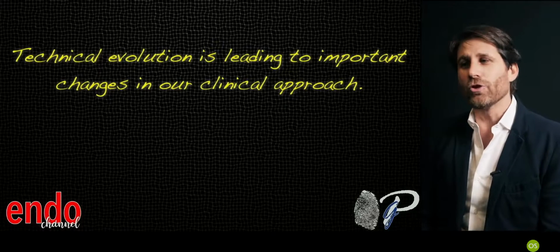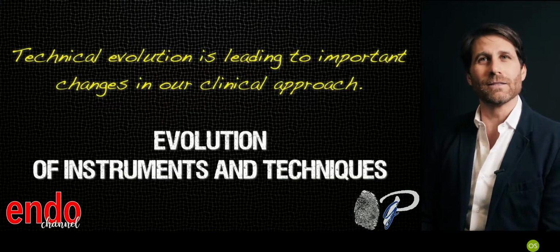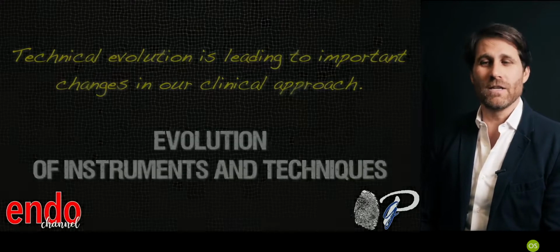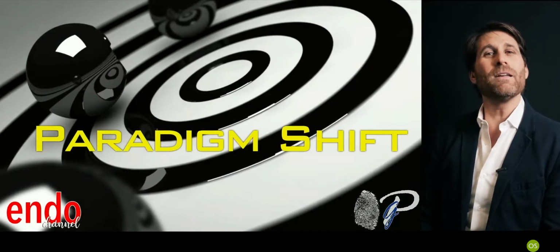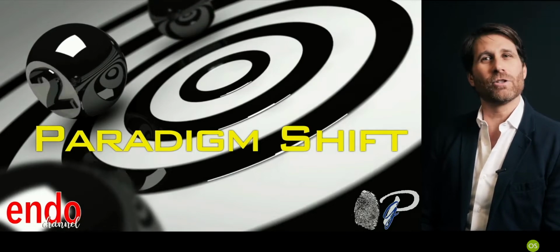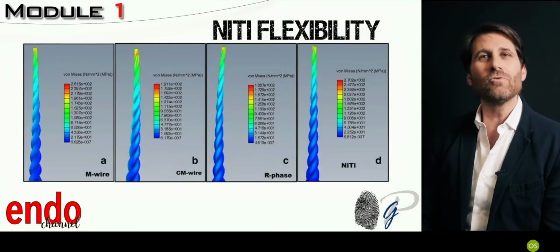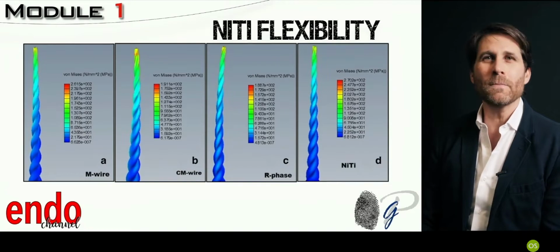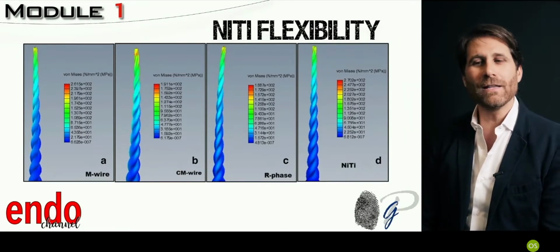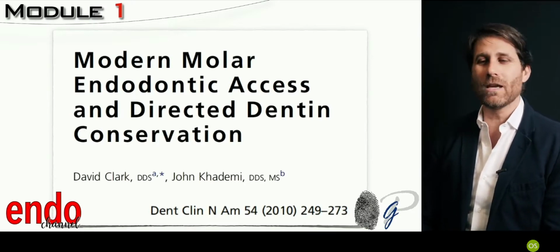Technical evolution is leading to important changes in our clinical approach. The evolution of instruments and techniques has given us a paradigm shift in our therapies. So we don't need to have myths and dogmas because everything is changing, the paradigms are shifting. And this is something that is happening very fast in the access cavity concept. Thanks to the flexibility of the new nickel titanium files, thanks to the properties and the resistance of these files, we can go over a modern molar endodontic access with the principles that David Clark and John Khademi gave us in this article. So very new principles that we can follow.